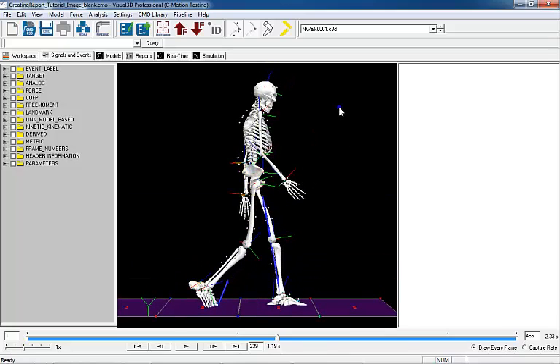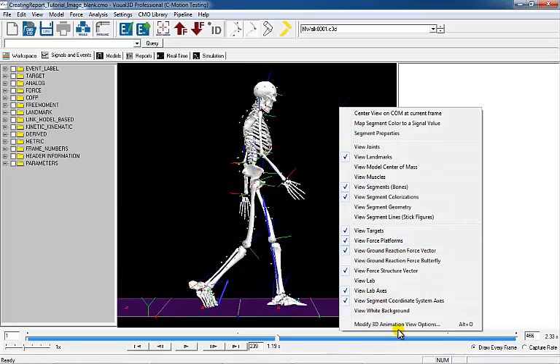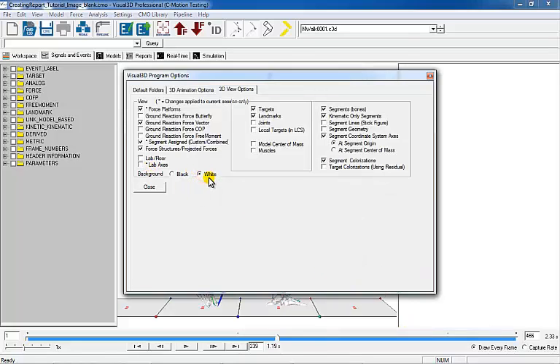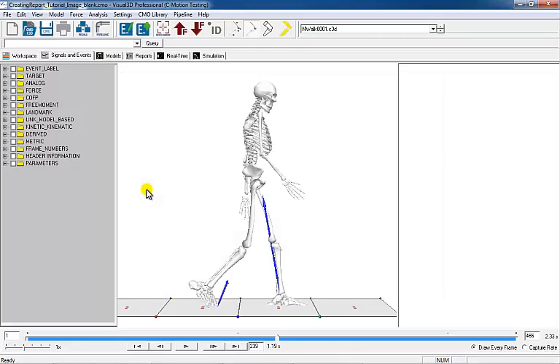Right click within the 3D viewer and modify the 3D animation view options. Turn off the lab axis, set the background color to white, and turn off the targets, landmarks, and segment coordinate system. The image is now ready to be exported.